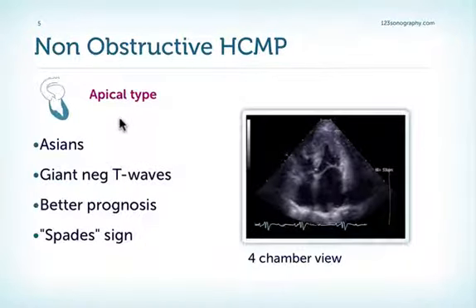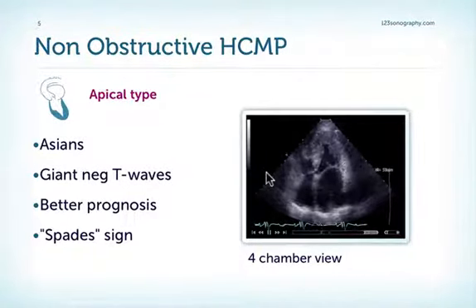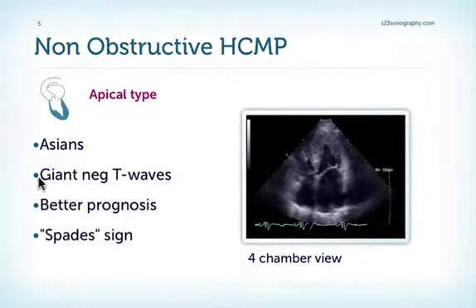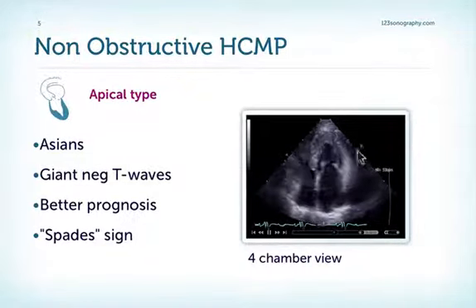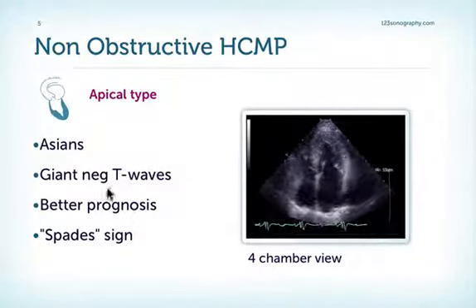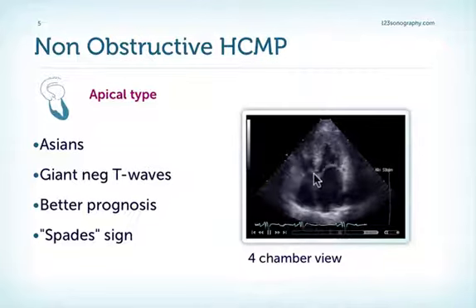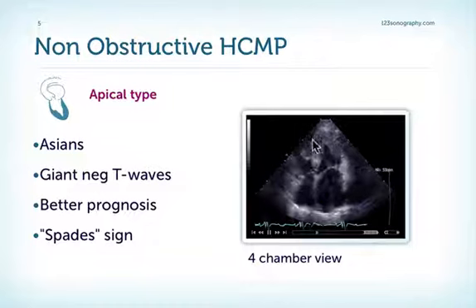Now let's take a look at the apical type of non-obstructive hypertrophic cardiomyopathy. It is a pathology which is more common — actually not infrequent — in the Asian population. It is characterized on ECG by the so-called giant negative T-waves. In general, it has a better prognosis than other forms of hypertrophic cardiomyopathy. The typical echocardiographic finding is hypertrophy of the apex, where the ventricle has the shape of a spade — the spade sign of apical hypertrophic cardiomyopathy. Note that we have significant left ventricular hypertrophy, which is more prominent the further we get to the apex.